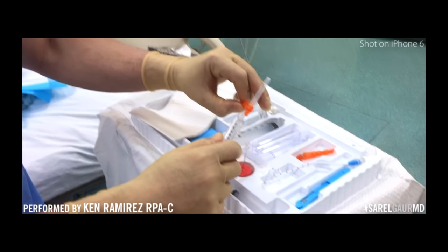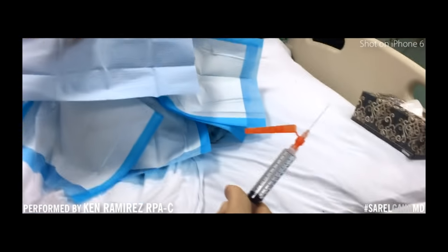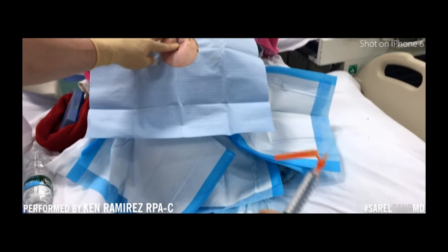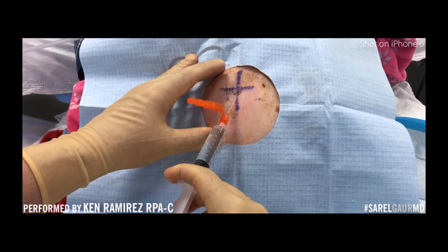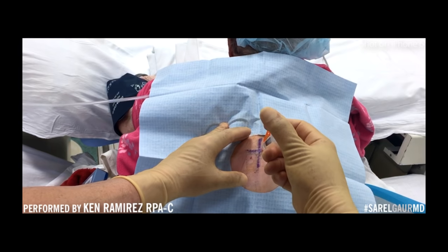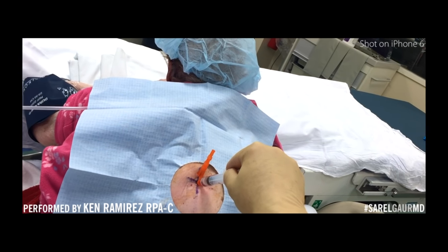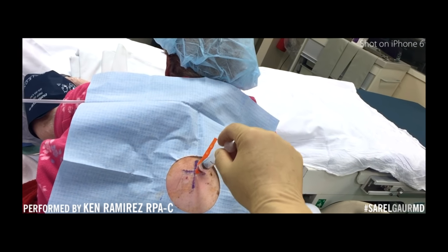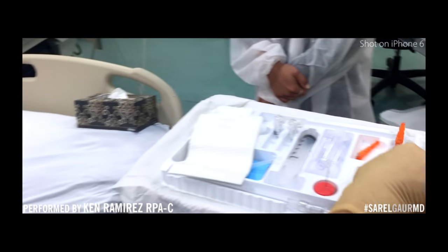We have two needles — I use the thinner one. I'm going to feel and see if I can go between the ribs and above the bottom one. You're going to feel a pinch. We make a little wheal, and then we're going to numb straight through. Once I get all the way in, I like to draw back and get a little fluid. Here I'm getting a little — it looks to be serosanguinous. Once I draw back and get that, I don't administer any more.